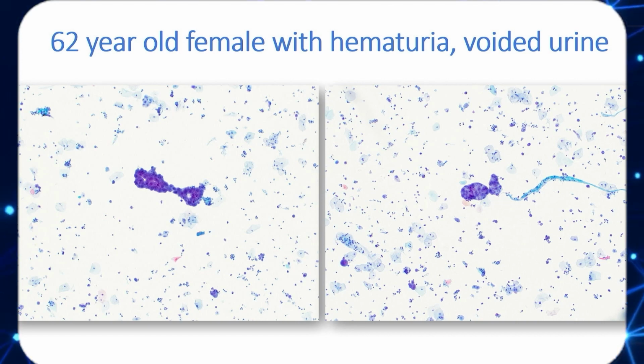You can see that here. Some hobnail appearance of the cells, flat sheets. Here there is three-dimensionality, but the cytoplasm is a little bit more abundant there. And this is still very much at a low power, and you can clearly recognize that this is a pathologic process. A higher magnification of those two images, again, illustrating some glandular differentiation with NC ratio, which is quite high.